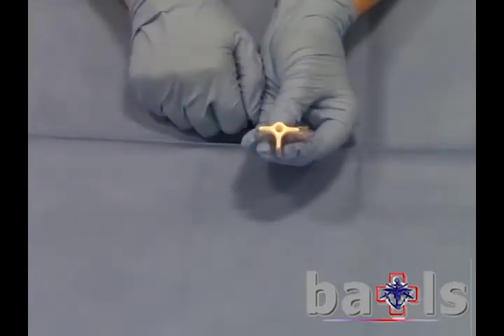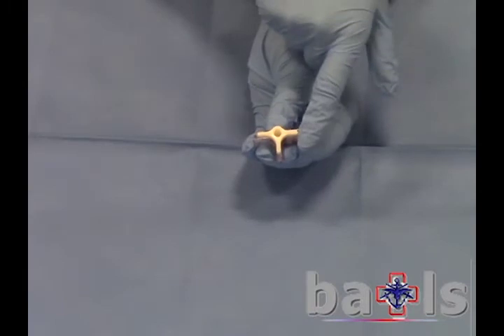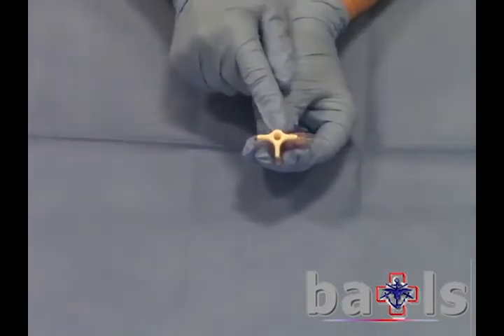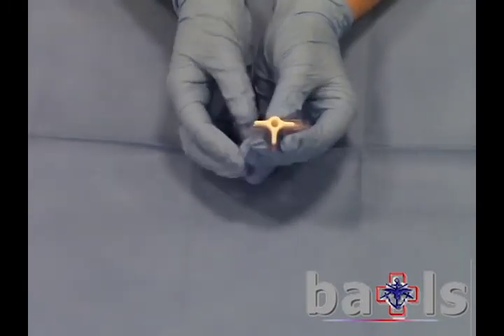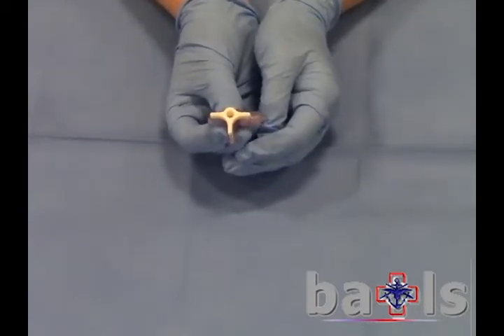The 3-way tap is constructed with three ports and a tap which has three open settings and one closed. This allows the caregiver to control the flow and the direction of fluids through the device.